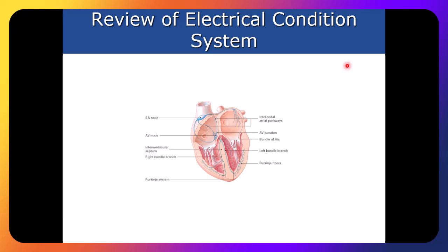Okay. So we've seen 2 things here. There's one more. So we can have no visible P wave. We can have an inverted P wave, or we could potentially see a P wave after the QRS. After the QRS. All right. That's going to be really important for you to remember. Now, again, here's the key to remember, as you'll see as we go through here. I think one of the reasons why the vast majority of this class did so well is you guys have become really, really expert in that 5-step process.